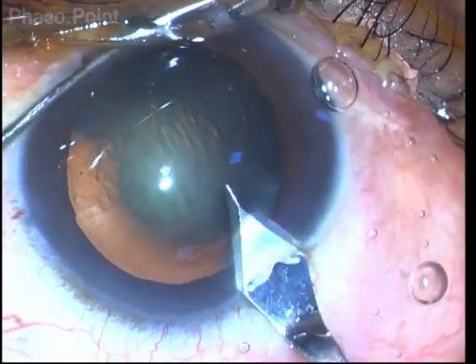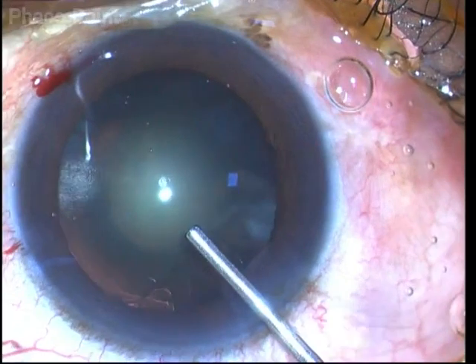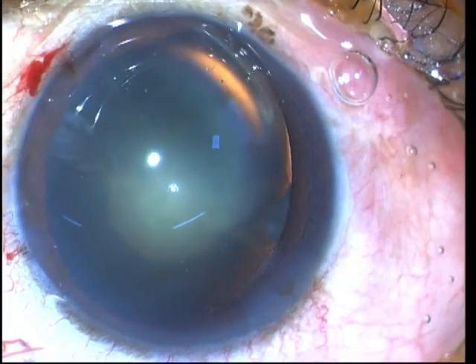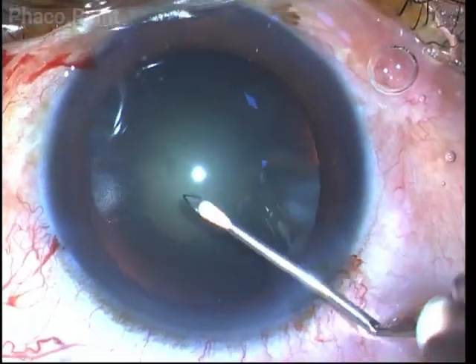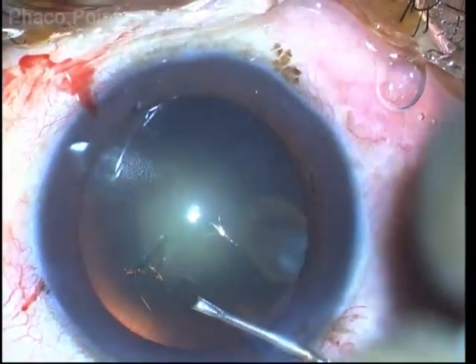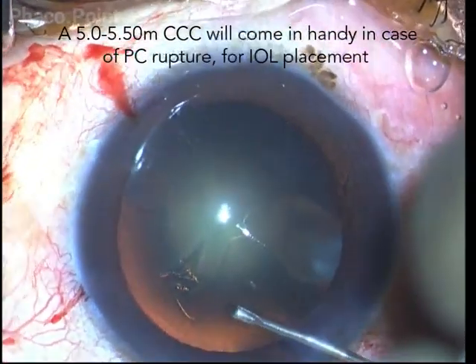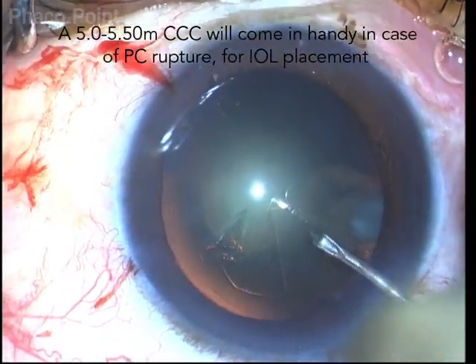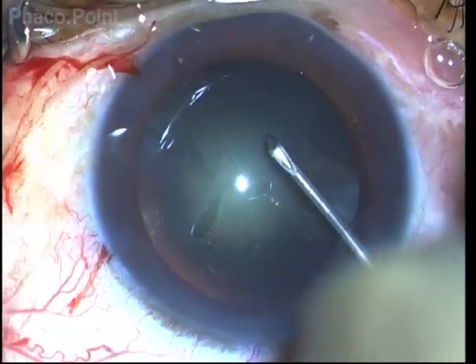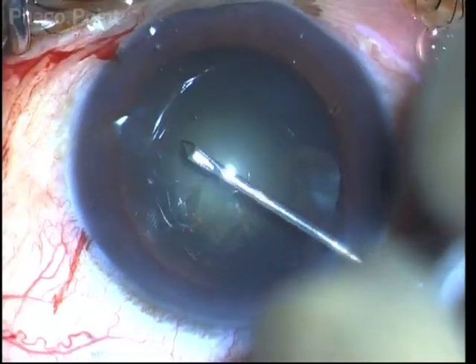We need to assess the grade of nucleus sclerosis that is present along with the polar cataract. Another important step is that we have to carefully and diligently fashion a 5 to 5.5 mm capsulorhexis, so that this will act as a saving device in case we encounter a posterior capsular rent, allowing us to capture the optic within the capsulorhexis margin.